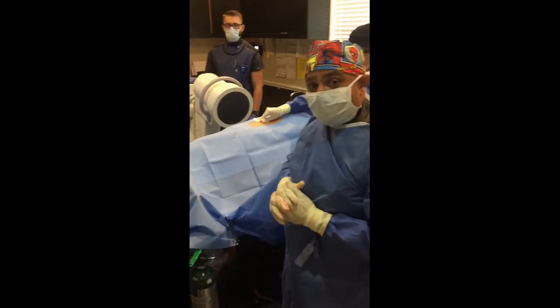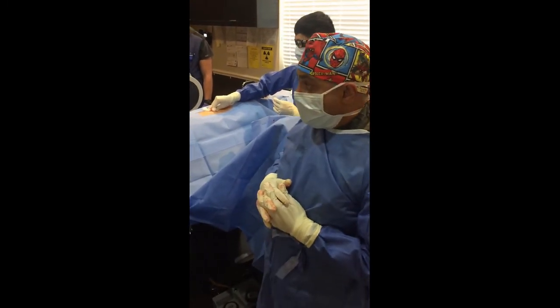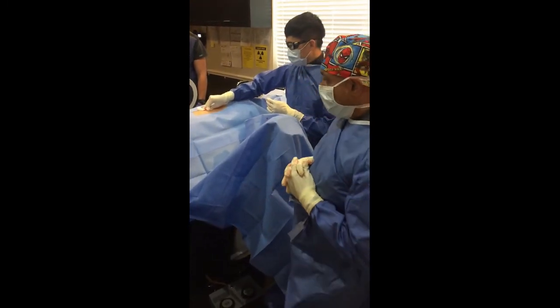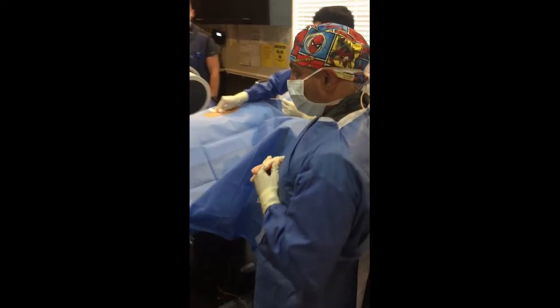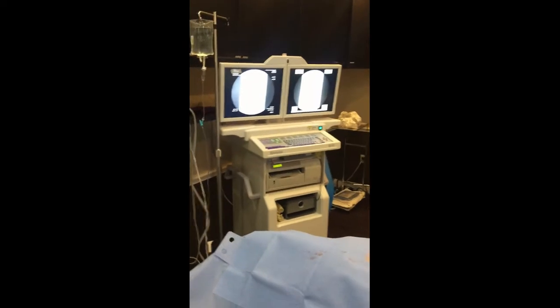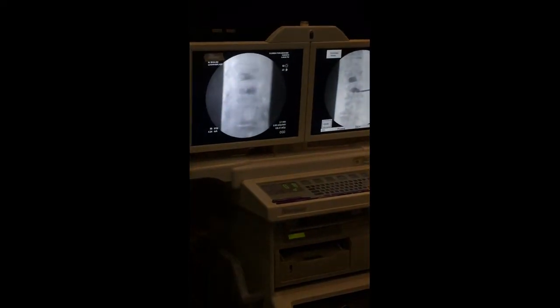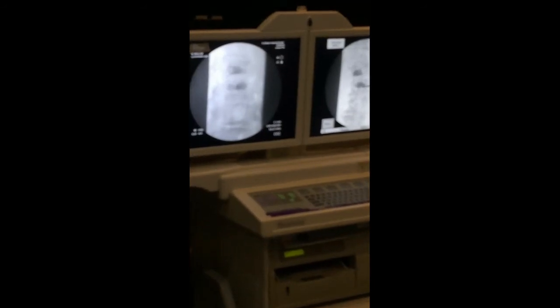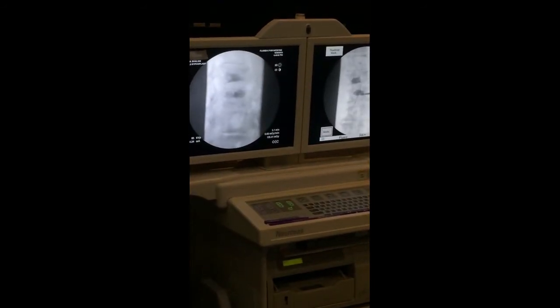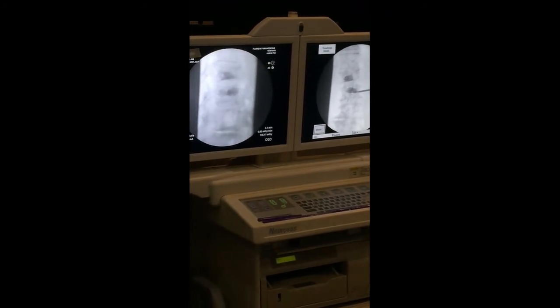So the procedure for the L2 kyphoplasty is now complete. Thanks to Dr. Chen, who is our USF fellow that's with us. If you look at the picture here, go ahead and come around with me. You can see her initial kyphoplasty at L1 and the kyphoplasty at L2. She's got excellent spread of the cement all the way through. There is no breakage of the anterior end plate or the posterior end plate of the wall.